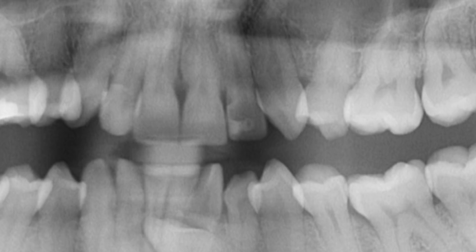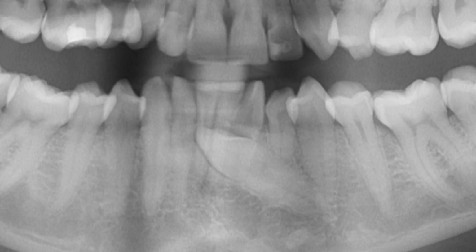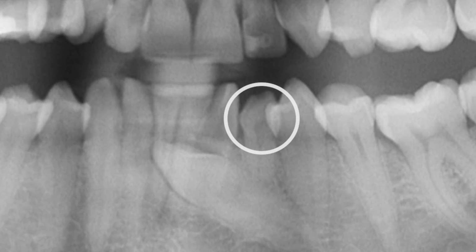So that's really weird. Apart from that, top teeth, though crooked as hell, I think they look okay. Bottom teeth, now then. Obviously the bottom teeth are crooked. Can I draw your attention, please, to the front at the bottom? Not that I think I need to. So I'm going to circle this so it's easy to show you, but you will see a gloriously huge mass pointing kind of upwards and a really tiny tooth near it. I'll tell you what that is, shall I?